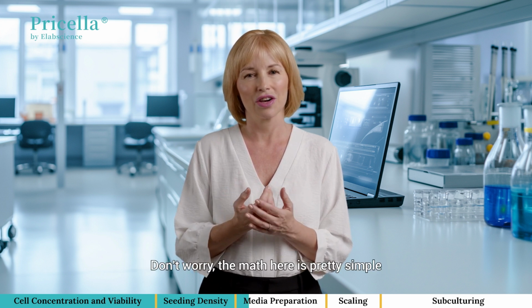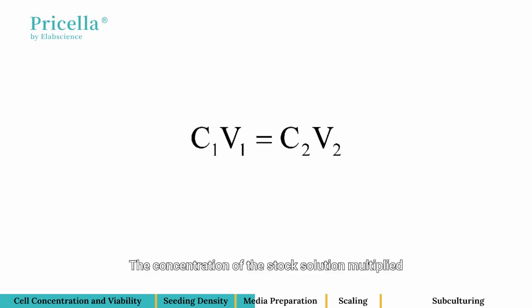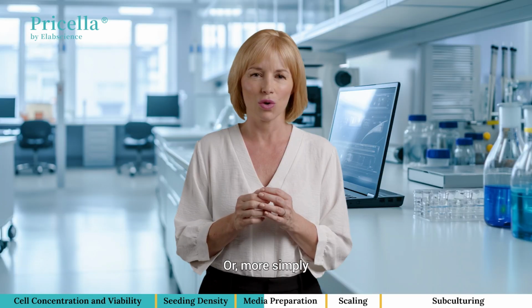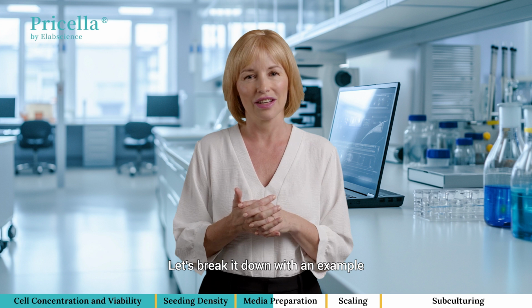Don't worry, the math here is pretty simple. You just need this formula. The concentration of the stock solution multiplied by its volume equals the concentration of the final solution multiplied by its volume, or, more simply, C1 times V1 equals C2 times V2. Let's break it down with an example.